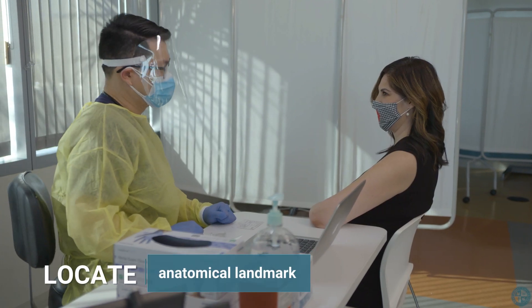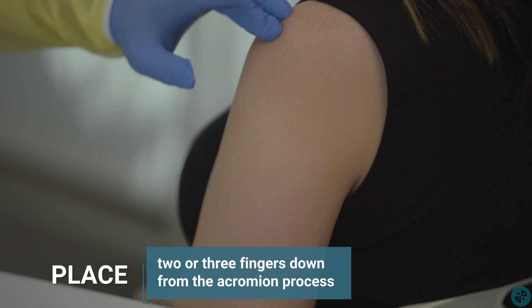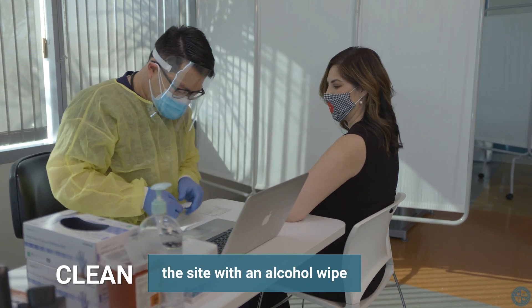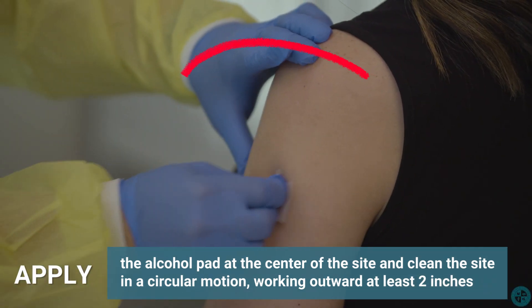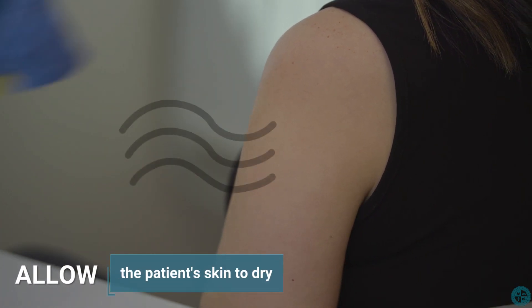To locate the anatomical landmark, place two or three fingers down from the acromion process and identify the deltoid muscle above the axillary line. Next, clean the site with an alcohol wipe. Apply the alcohol pad at the center of the site and clean the site in a circular motion, working outward at least two inches. After you finish, allow the patient's skin to dry.